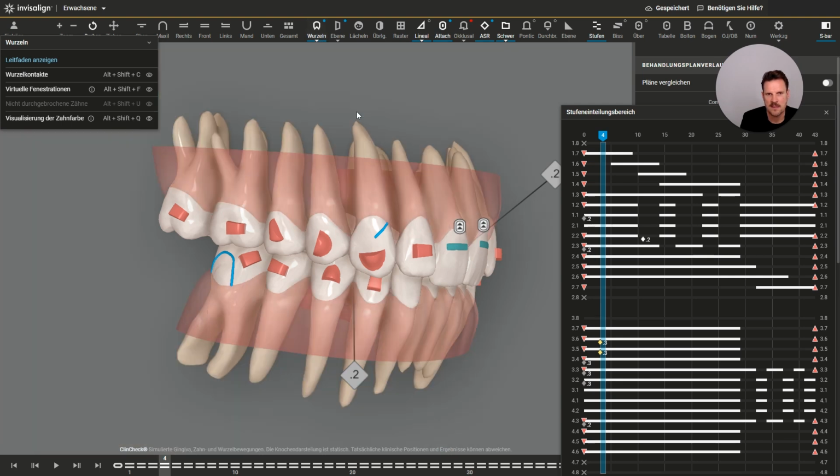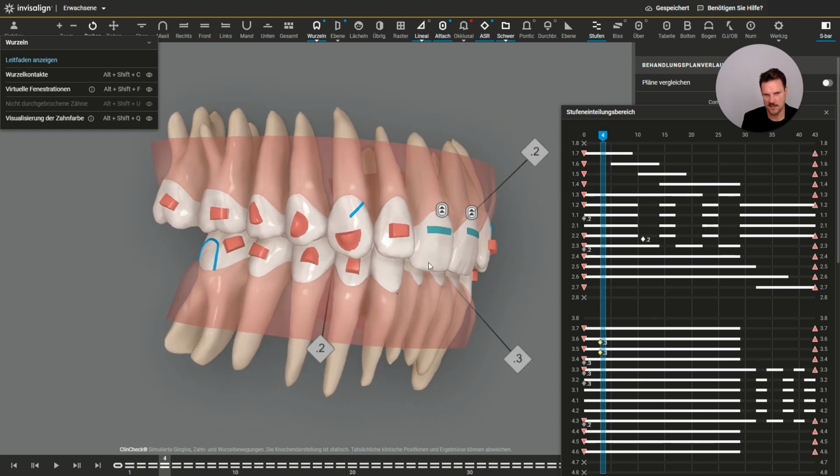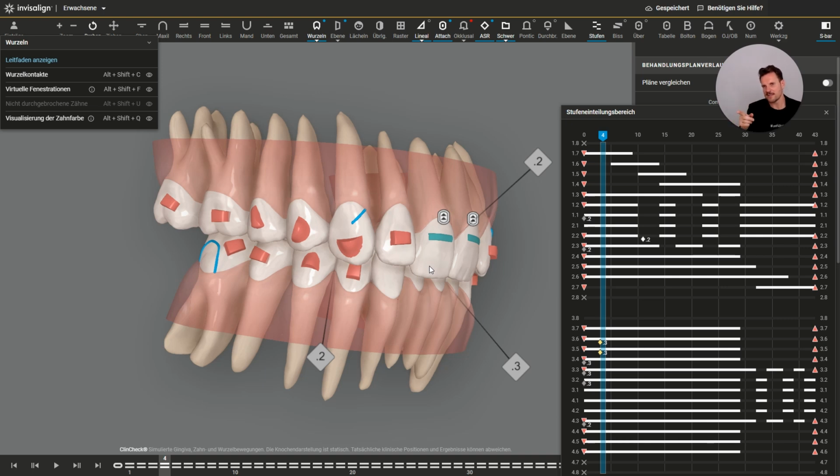But with Invisalign, you cannot change the trim line. So the trim line is always the same. But Invisalign is the only system with optimized attachments. So we have a different force system with Invisalign, which is very important to understand. So we do not need to change the trim line. We also have different functions like power ridges and so on, which I will explain in much more detail in the next modules. But just for you to understand now, I explained all the differences.